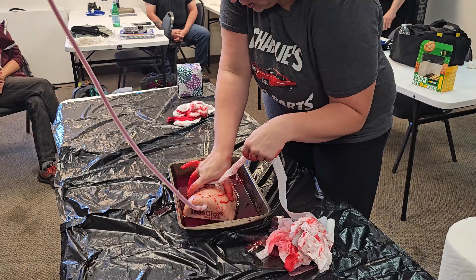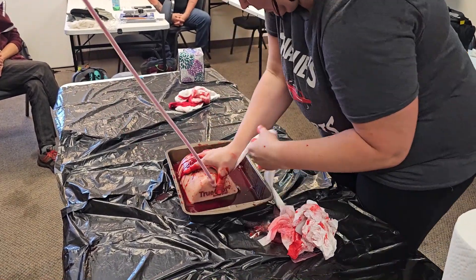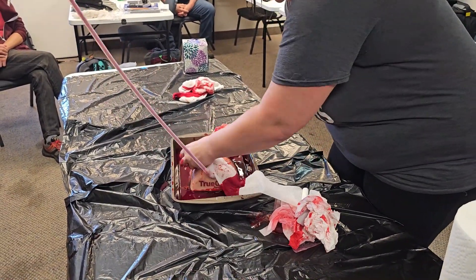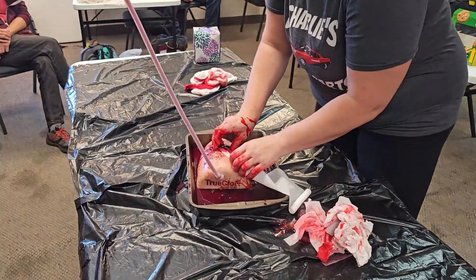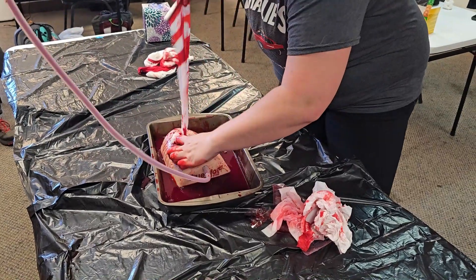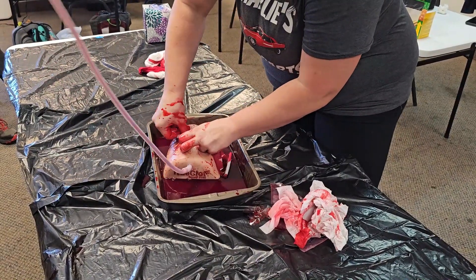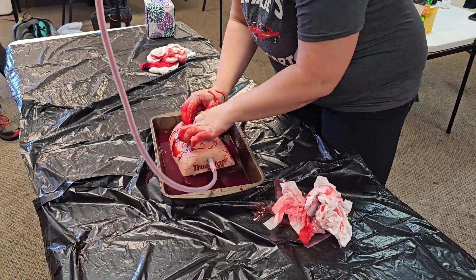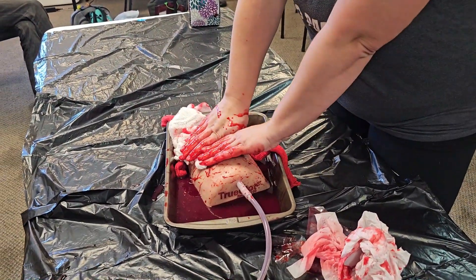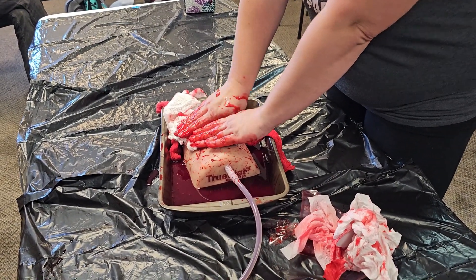Yeah, this hurts, I know — but we've got to get it to stop. Keep going, keep going. A lot of blood coming out of there — start getting that material in there, get it in deep, all directions. There you go. Good, keep going — is the blood still coming up? Pack it, pack it, pack it. Good — and on top — you still have more material right there, just grab that one and put it on top. Then we hold there for as long as we need to, or we put something on top. Good job.